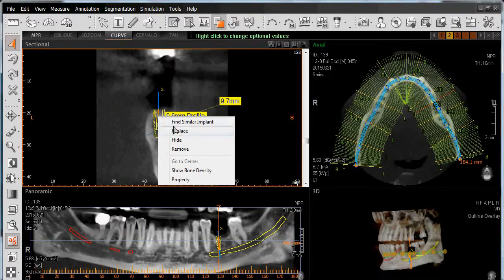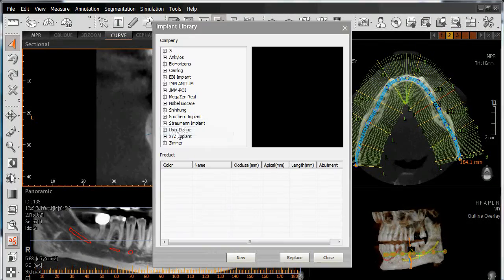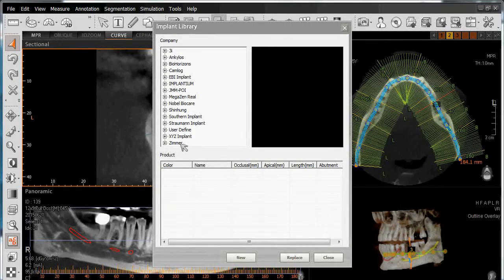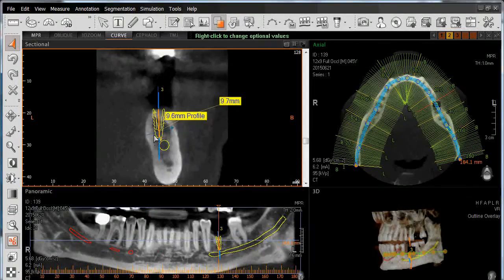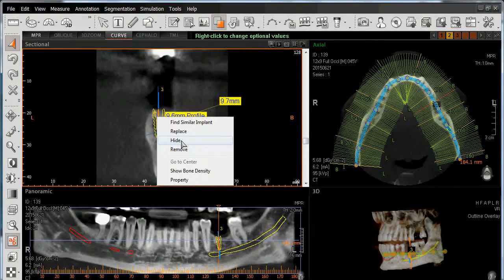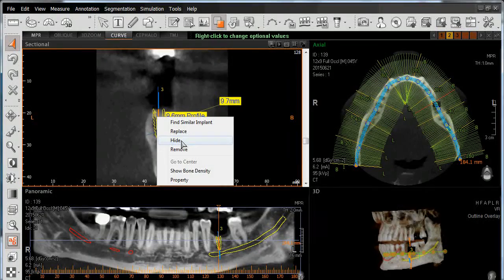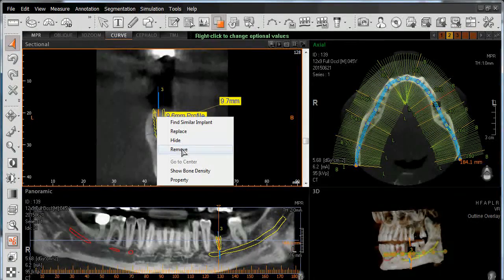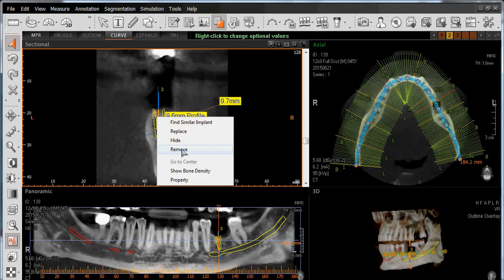If I right-click again, I can left-click on Replace and then go back to my main implant library and choose from a completely different manufacturer. Continuing to right-click, I can hide this implant if I want to place multiple implants in the same site to find the best and most suitable implant system. I can also left-click on Remove to delete it.